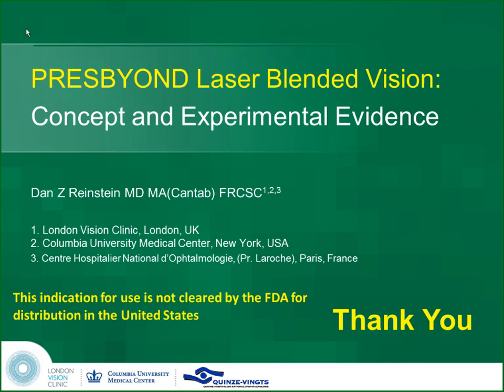And in hyperopia, it's the same principle. And in emmetropia, it's about perhaps driving the spherical aberration up slightly because it might not be enough. But that's why we do a wavefront measurement before surgery. We import the wavefront, and based on age factors, accommodation relative to the age of the patient, because it could be a little bit less or more than their age, we can actually control this spherical aberration to optimize what the brain can do to understand the image. What level are you controlling for? What is your threshold that you have here?